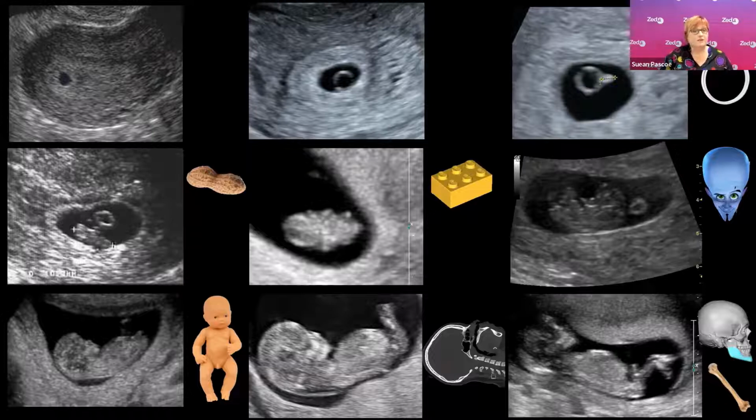So the reason I take you through these appearances of the gestation, a week-by-week approach, is when we're scanning, what I tend to do is have a look at what I'm seeing embryologically and what has formed embryologically, and I'm making a rough estimate of the fetal age. So I want to be able to guesstimate, if you like, with a 2-week sort of room for error, just by looking at the fetal development, how far along this gestation is.